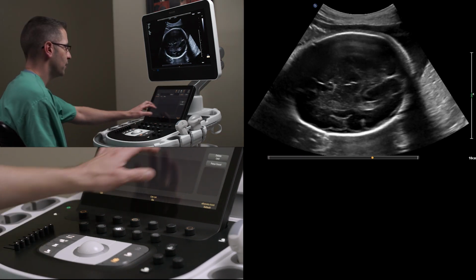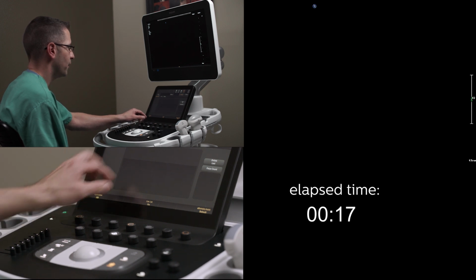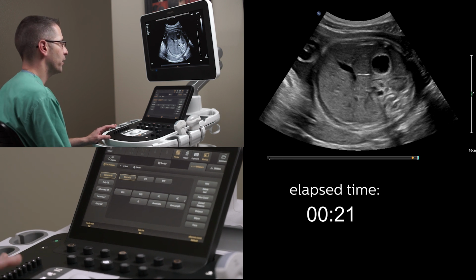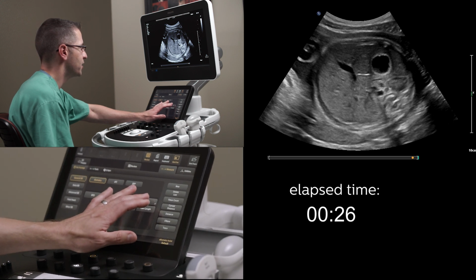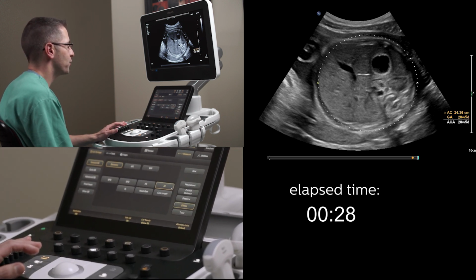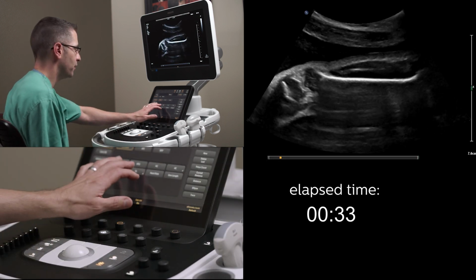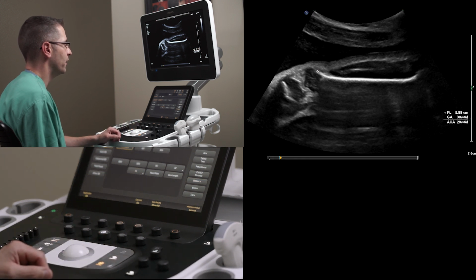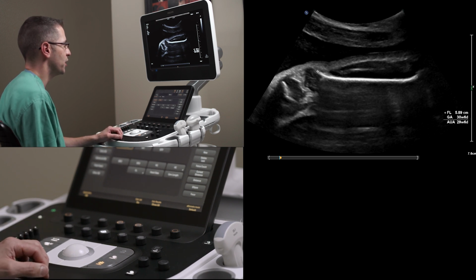To our next image, and we need to select the belly. Instead of measuring the entire ellipse, adjusting it, we've collected and frozen our abdominal circumference image. We're going to press the AC button, and the abdominal circumference deploys perfectly, and we accept that. We are simply going to hit the femur length, and it deploys in a perfect fashion, measuring the bone the way we would want without any manipulation using the roller ball or the touch buttons on the machine interface.